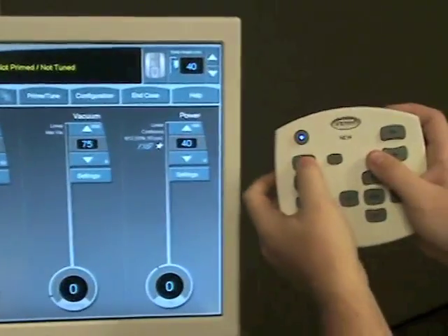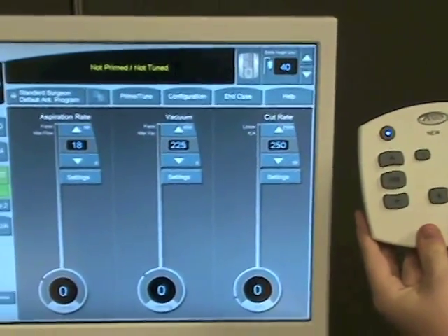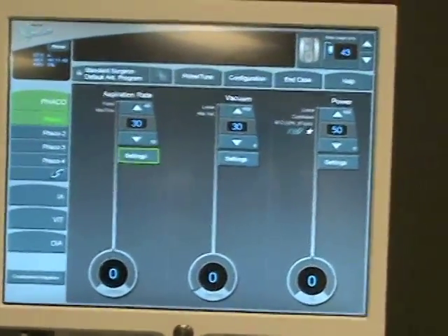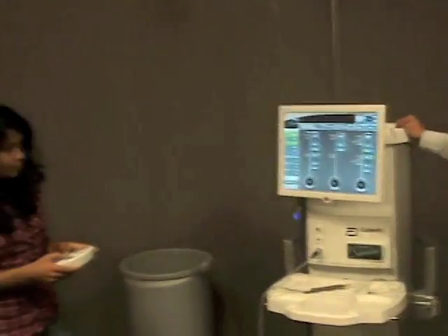The basic premise of our design was to create a touchscreen remote that would mimic the interface of the actual White Star system. This way, nurses who had previously used the White Star system would find our remote control intuitive. Initially, we started off with the hopes of having the remote as an application on the iPhone. However, we were concerned that this may lead to non-cognitive errors and other complications.